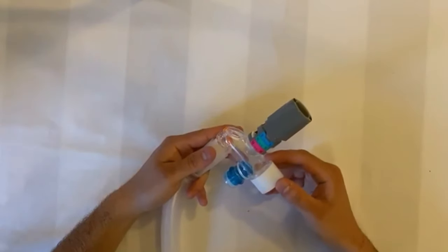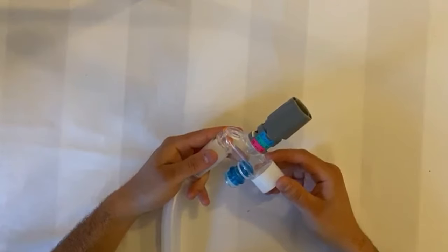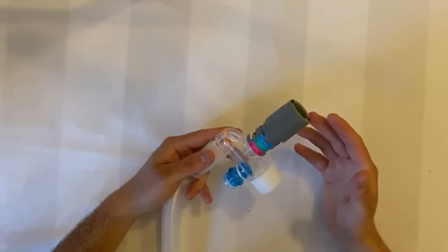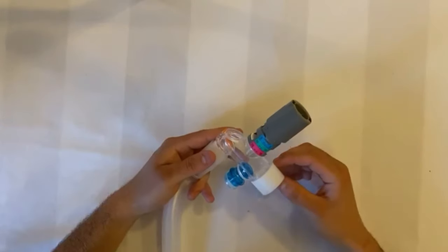At the other end of the tubing, we find the T-valve that connects the circuit to the oronasal mask. On top of this valve you will find the mechanical PEEP dial, with which you set your desired PEEP for therapy. This adjustment is independent of both flow and FiO2.